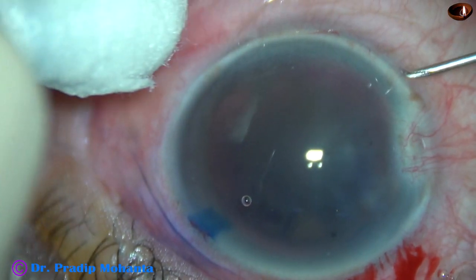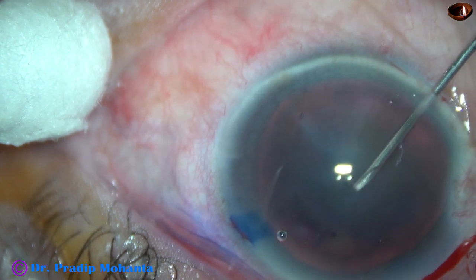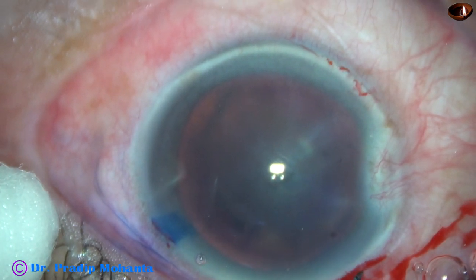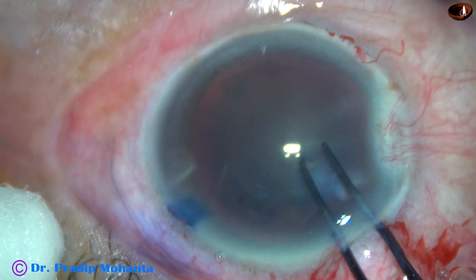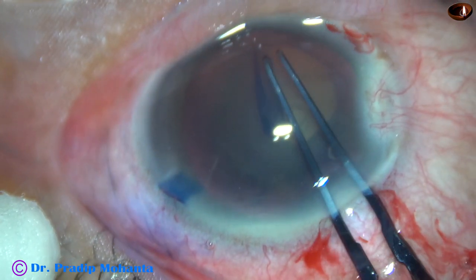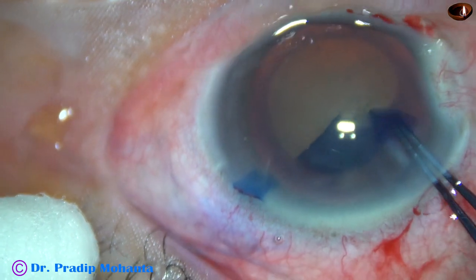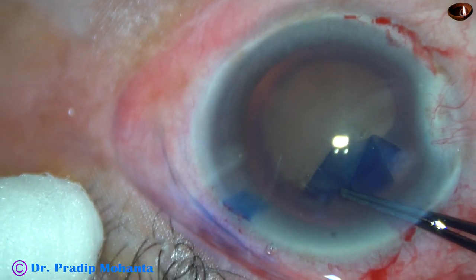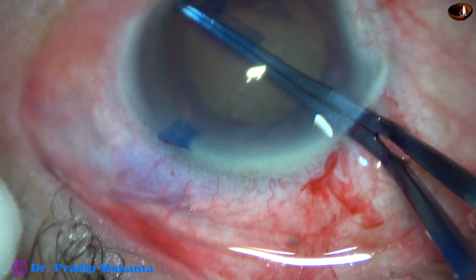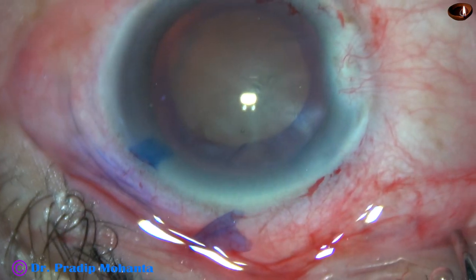The cataract is quite hard, and at this moment I am trying to do a capsulorhexis. I am using a needle to incise the capsule and raise the capsular tag. Since the size of the incision is only 2.2mm, the utrata forceps will have restricted movements. But still, we can do the rhexis with this 2.2mm wound with this thin utrata forceps. This is an adequate sized rhexis of about 5.5mm.